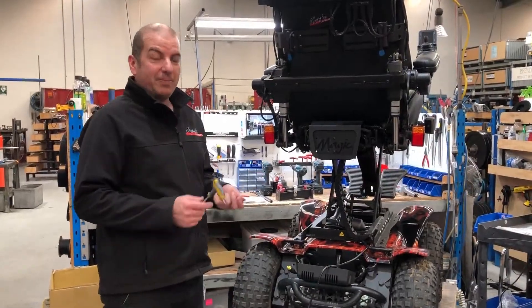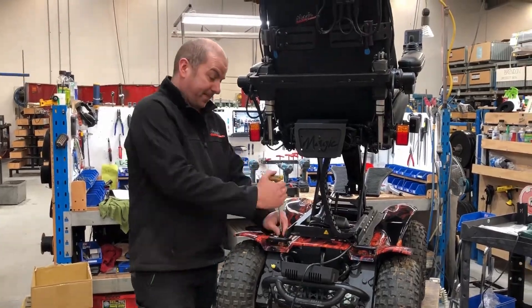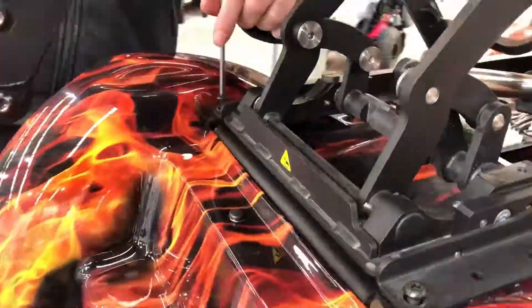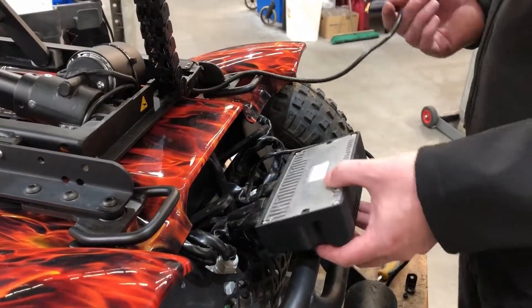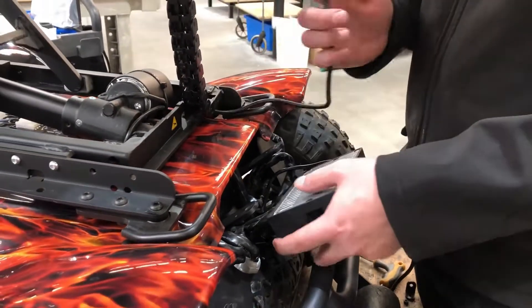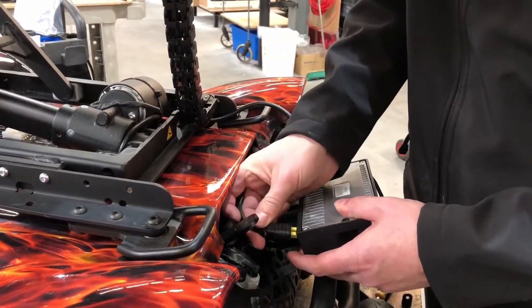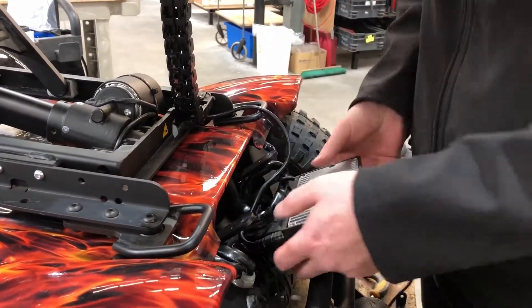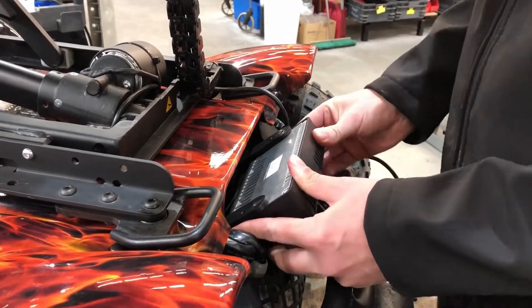Now that our seat's back on, we refit the four bolts in each corner and do them up nice and tight. Now that our seat unit's back on, we hook up the electronics — we'll get our CAN bus cable and plug it back into the power module, then bolt the power module back onto the chair.